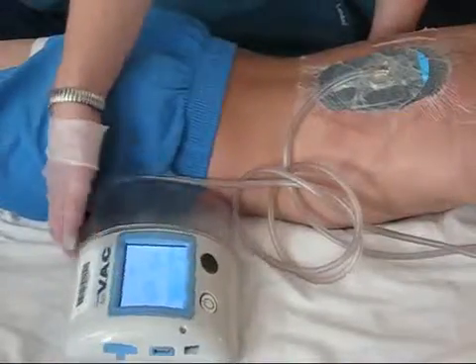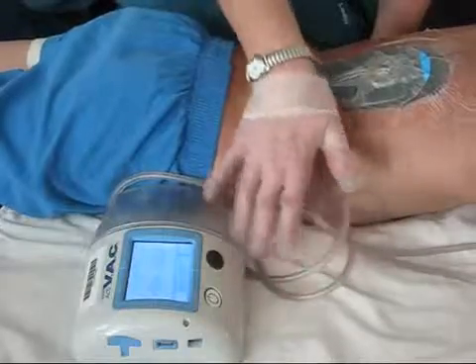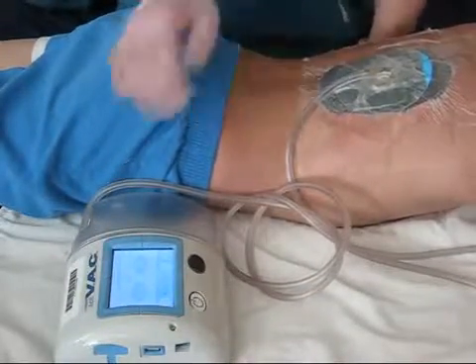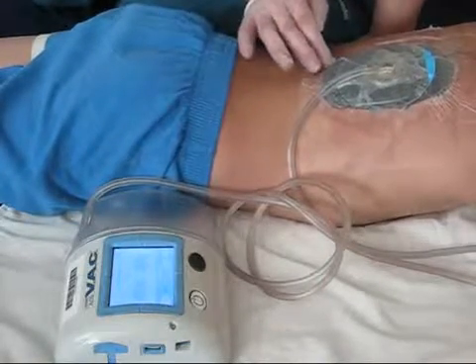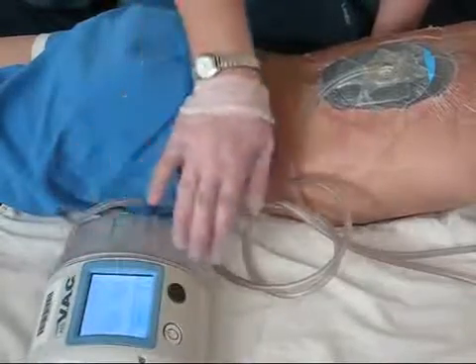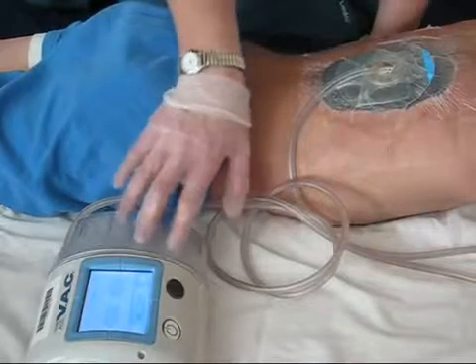Once any leaks have been eliminated, make sure that you check the wound vac several times throughout the day, to make sure that you haven't developed any new leaks, and seal them off if any have. And you'll want to record the drainage that is in the collection canister in your I&Os.